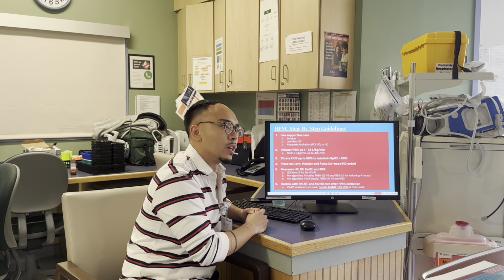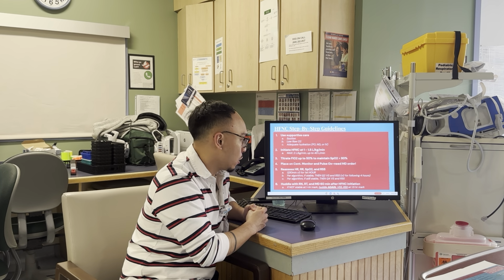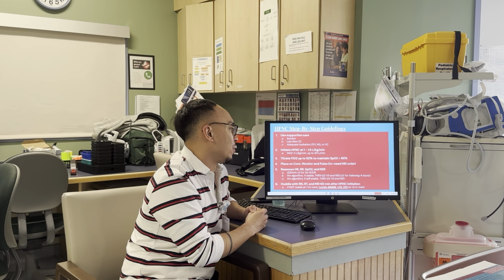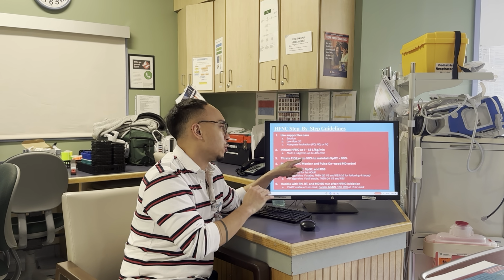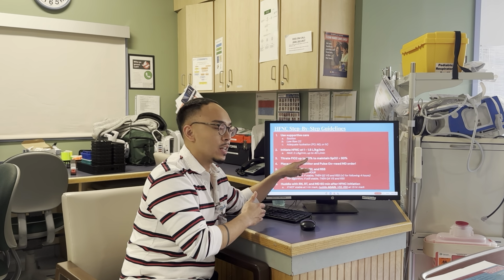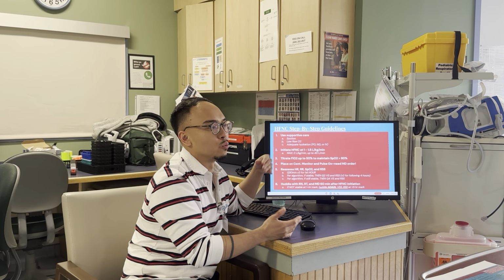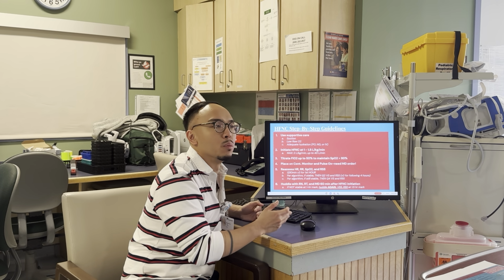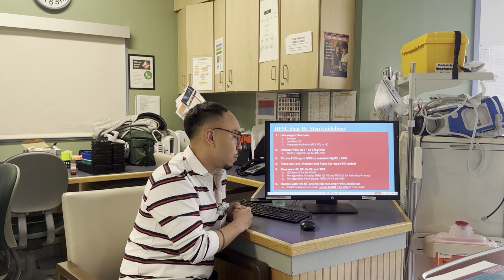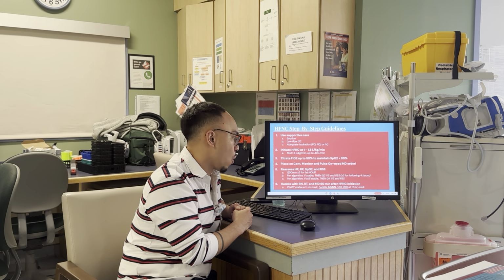We're going to practice with our case studies, all right? You could also titrate the FiO2 up to 50% to maintain pulse ox greater than 90. So what that means, if our patient, when they're stable, needs greater than 50%, let's say they're steady at 60 or 70%, that means their needs are higher and they need to be transferred out because we can't adequately keep them here, especially with such high needs. You're also going to place the patient on a continuous monitor and pulse ox. Make sure you put an MD order because that requires that.